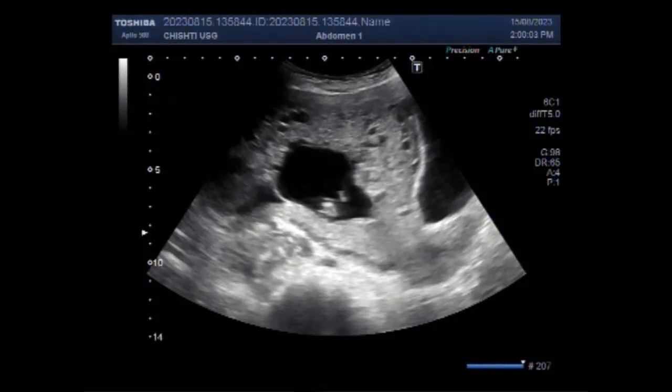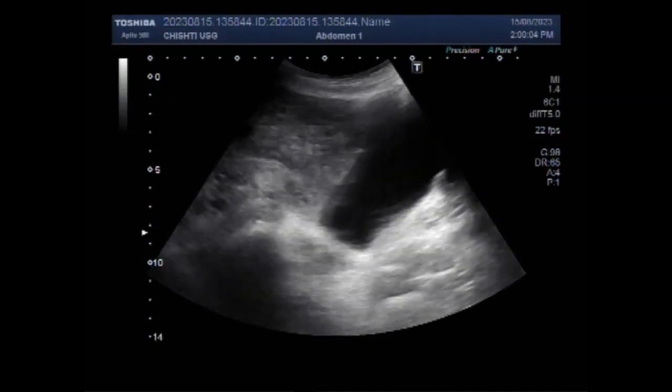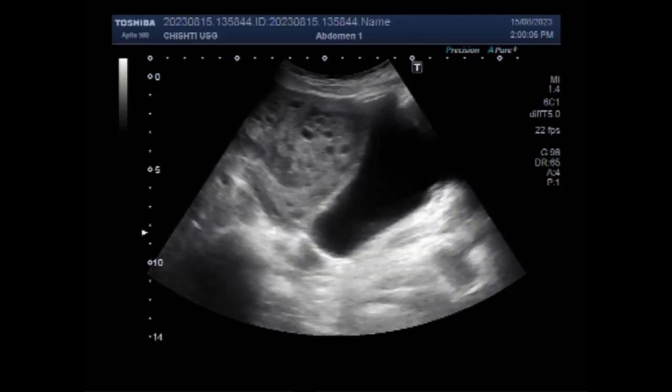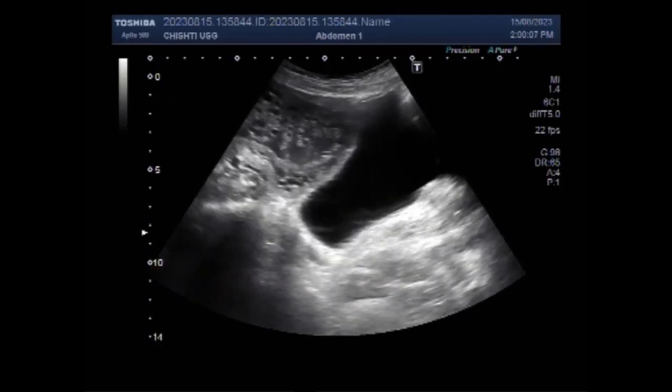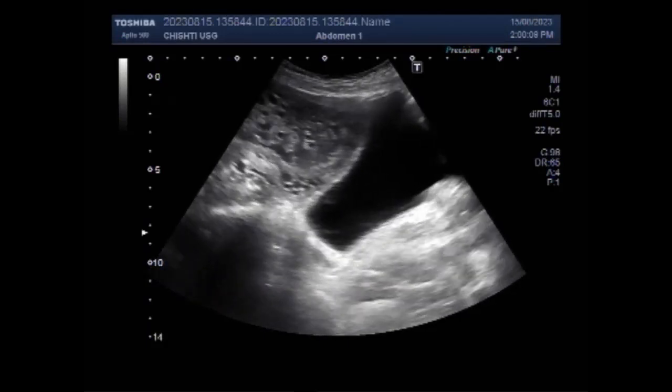Dear viewers, I hope you are all fine. This ultrasound video shows a twin molar pregnancy with fetal demise.